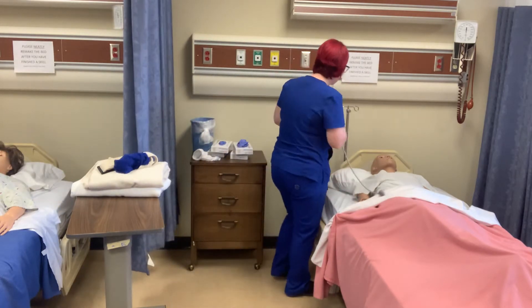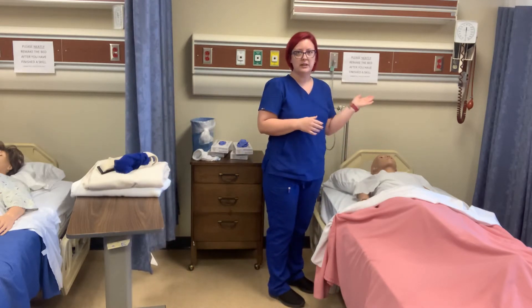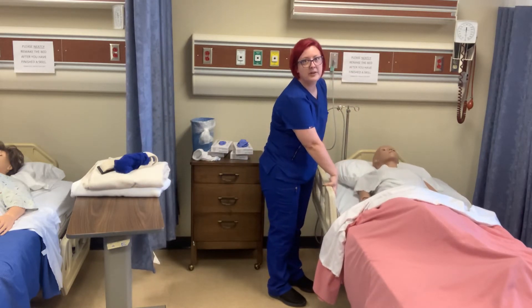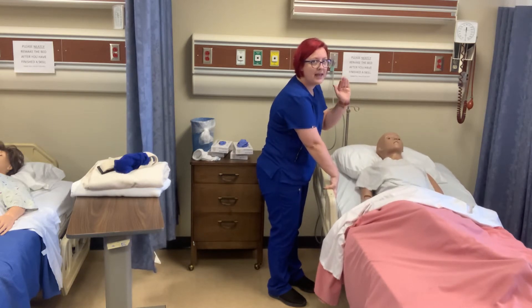So I'm going to get his call light just out of the way, and then we are going to set the head up to Fowler's position. We do not have to put side rails up because we're not raising the height of the bed — we're only raising the head of the bed.